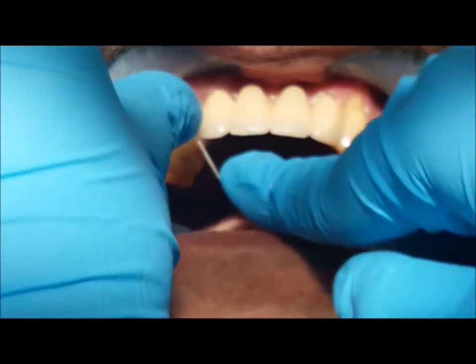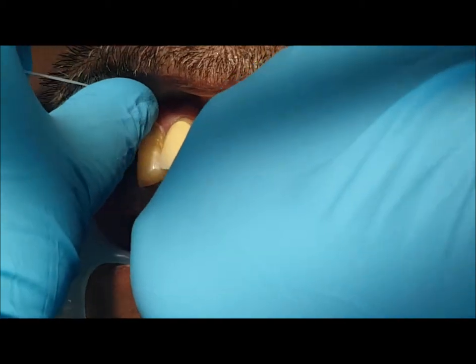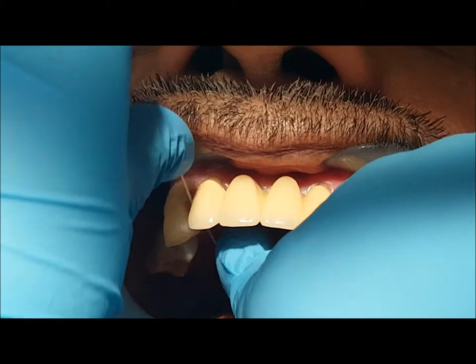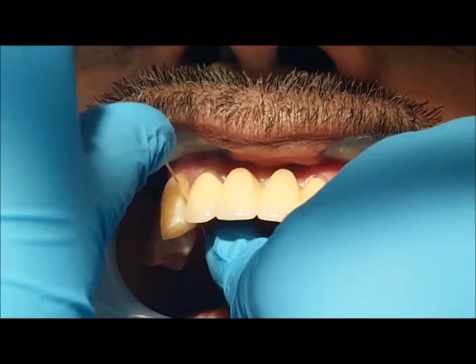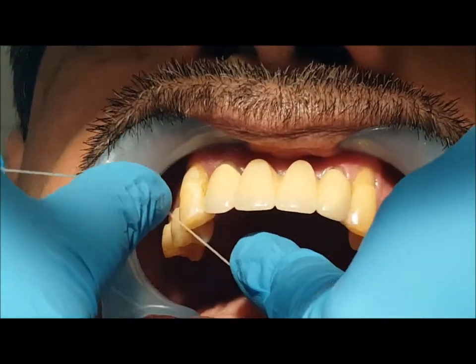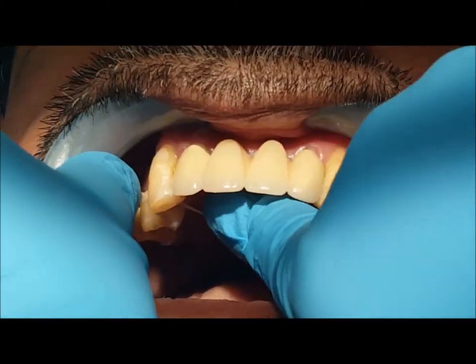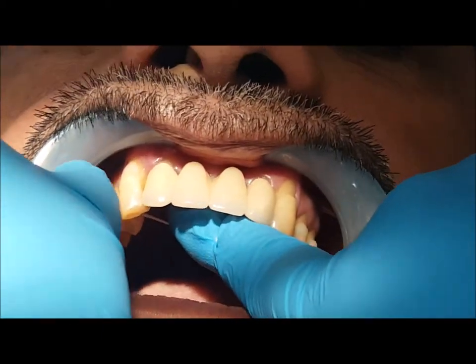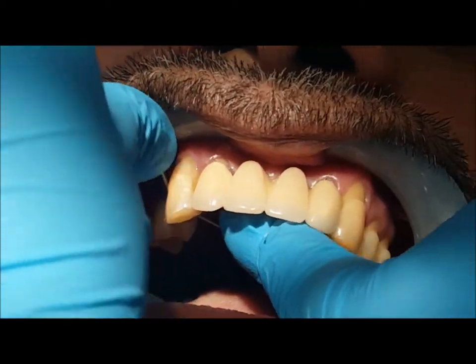It is also important to floss in between the teeth adjacent to where the abutments are. Go to the posterior and do it for all the other natural teeth as well. Lastly, visit your dentist regularly for maintenance of the bridge and professional cleaning.